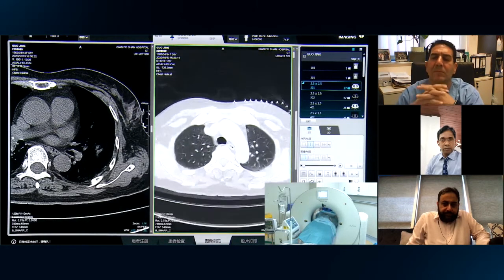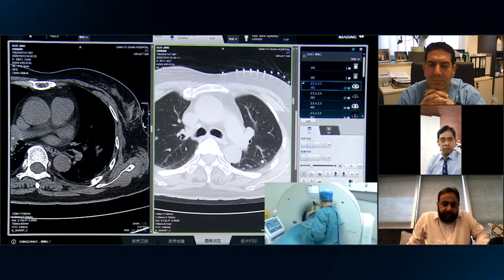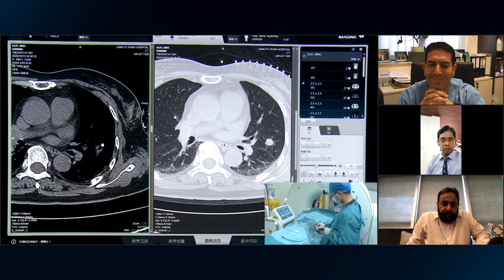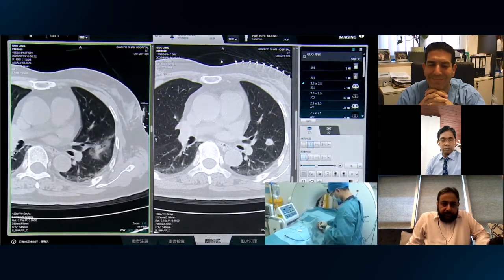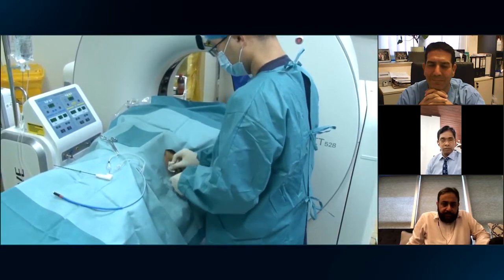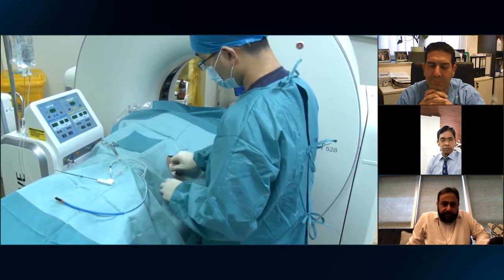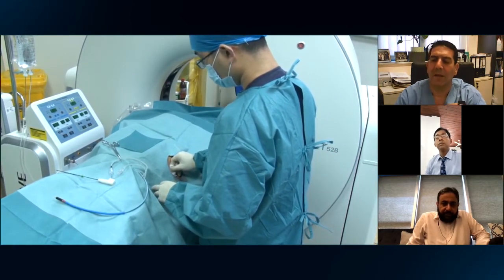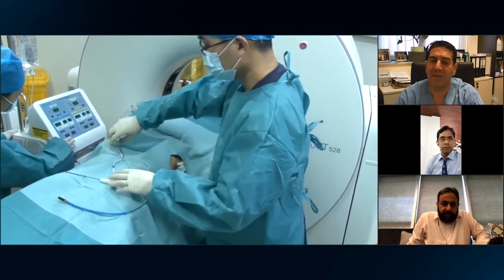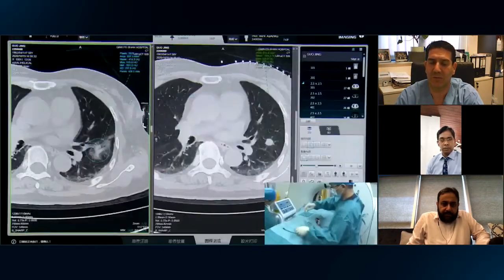Oh, okay. Dr. Alexis is preparing the next operation. So during this gap, I prepared 3 cases of lung ablation to show you. Is that okay? Yes, can we first cover the question that was asked? What are the possible complications that we expect from an ablation?